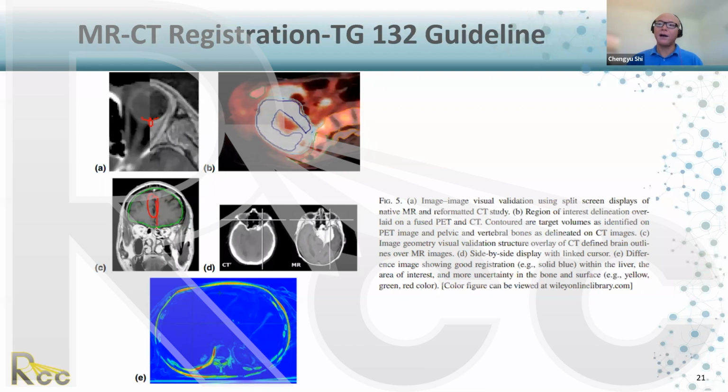Make sure the lines are straight and within millimeter tolerances. Certain eyes or certain bone here and nerves, optical nerves, those are good features. And if you can see the differences of the images, that also helps you say, oh wow, it's good. It depends on what kind of treatment. You try to make sure it's 1 millimeter, and on the other side maybe 2 or 3 millimeters are still okay, but you do the best you can.